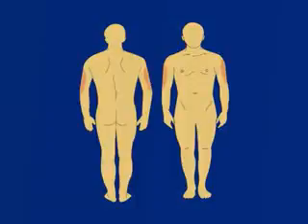Then select an appropriate injection site. The best choices are the outer aspect of the upper arms, abdomen 1 to 2 inches from the umbilicus, and anterior and lateral aspects of the thighs. Other options include the scapular areas of the upper back and upper ventral or dorsal gluteal areas.